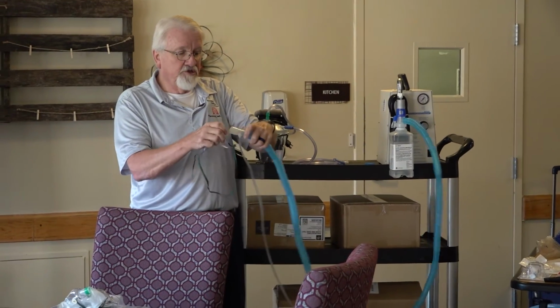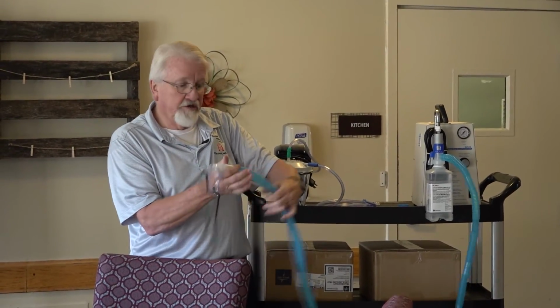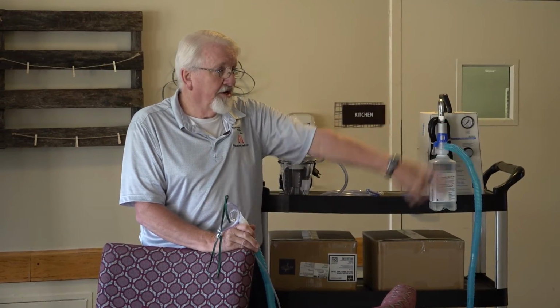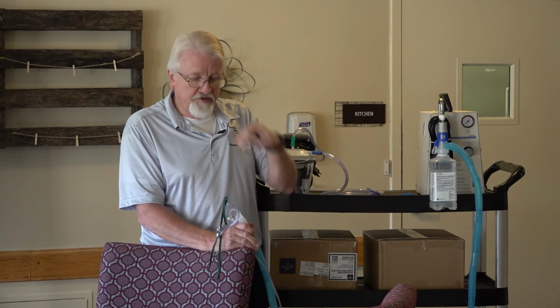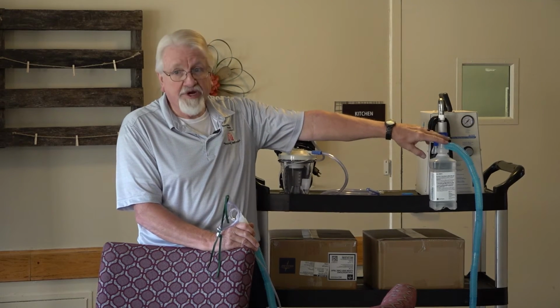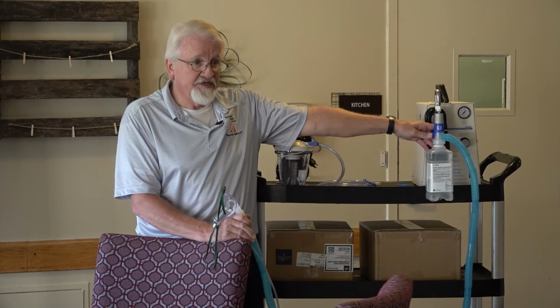You can put this in line either here nearest the patient, or most folks will put it back here and let it bleed in, but anywhere in line. The only difference is you may want to have an oxygen analyzer to see actually what you're putting out at the end, because remember, you are entraining air in addition to controlling the humidity with this.